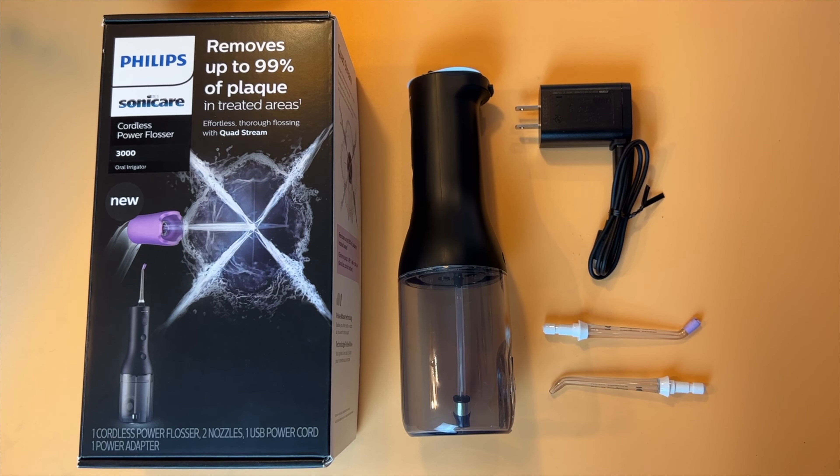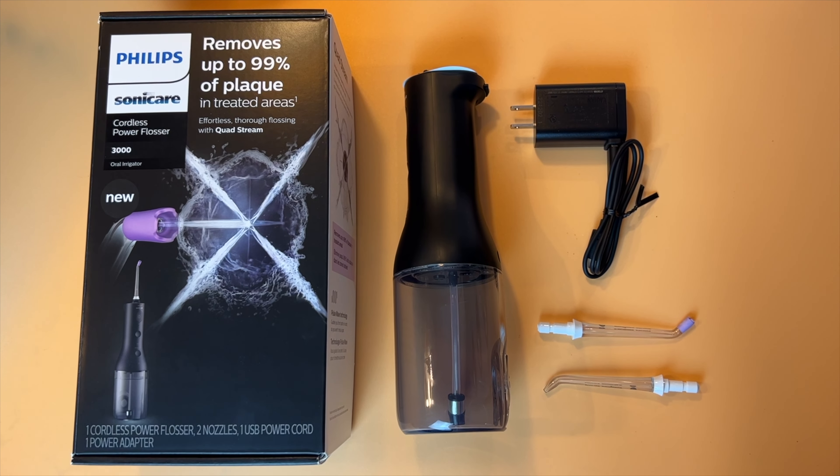So I was interested when recently Philips offered me the opportunity to try out a new water flosser. Admittedly, I was surprised because I thought those came and went in the 1990s, but it turns out the technology is still around and there's been some improvement.